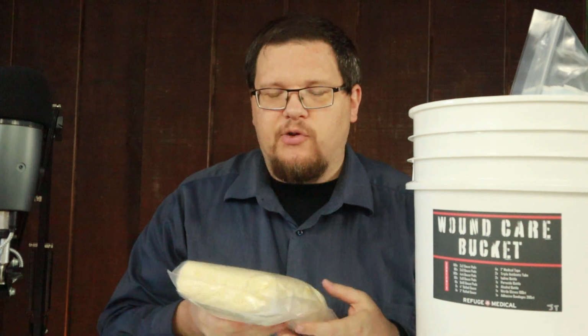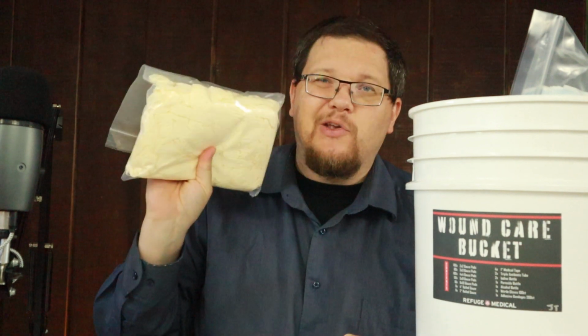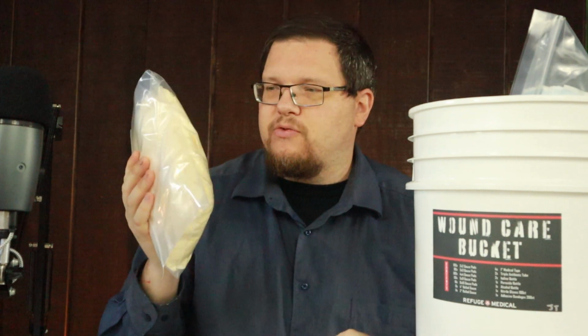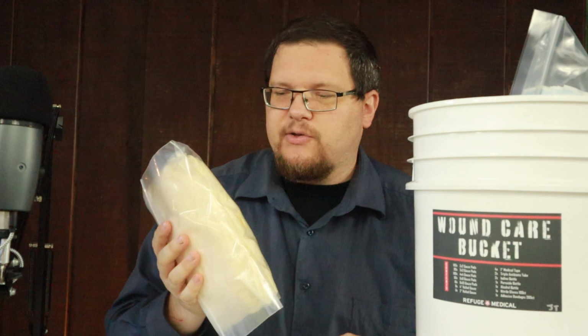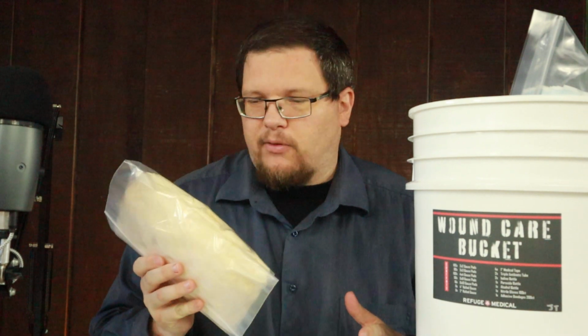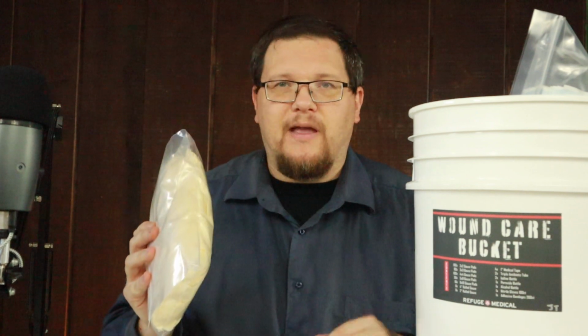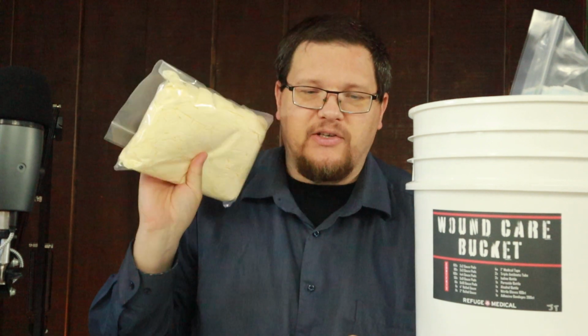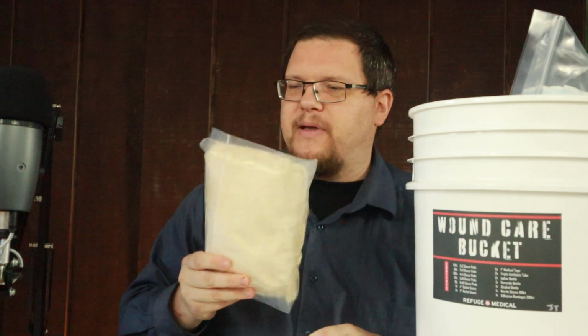That way you don't get blood on your hands. You need to protect yourself. You have little cuts on your hands from working outside, digging in the dirt and all that kind of stuff. You're going to need nitrile gloves to keep the blood from getting into your system and potentially infecting you. And also, you don't want to infect the people that you're trying to help. If you've been working outside, you're going to have rough calluses on your hands, and it's going to be harder to get your hands sanitized. So nitrile gloves are definitely a big go.